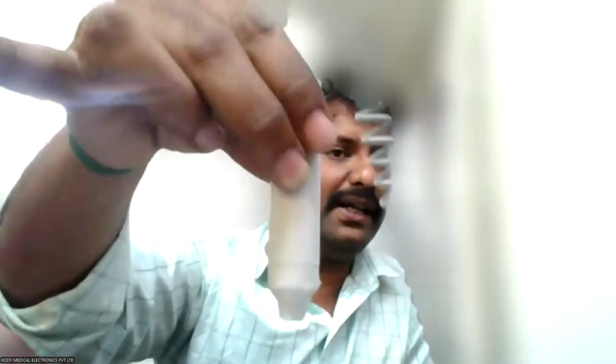Even when I place it on the artery, if I place it in the wrong direction, it won't pick up. A 45 to 60 degree angle of placement is required even for intraoperative purposes.